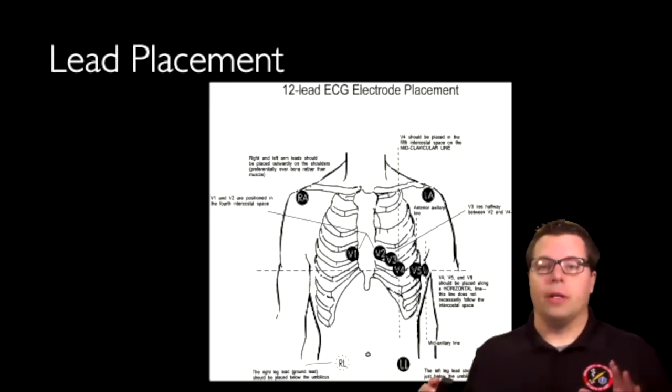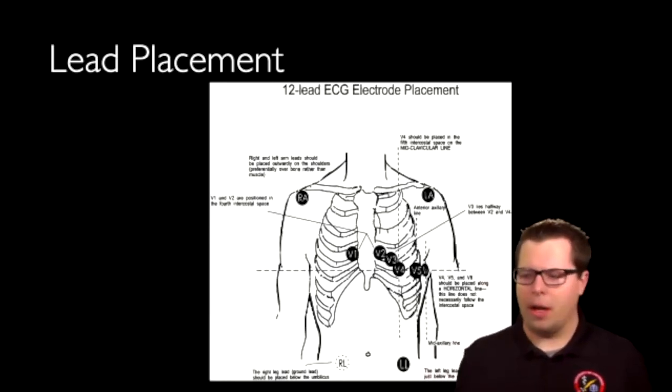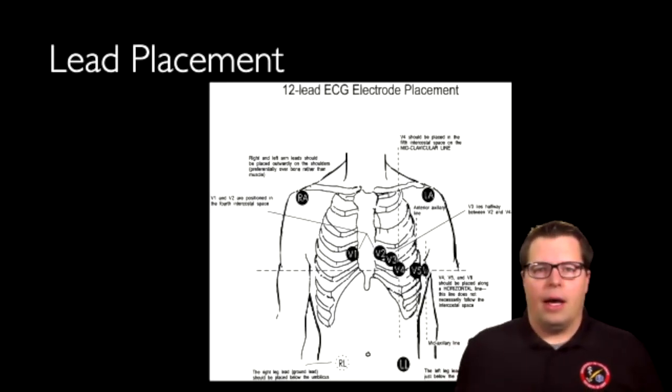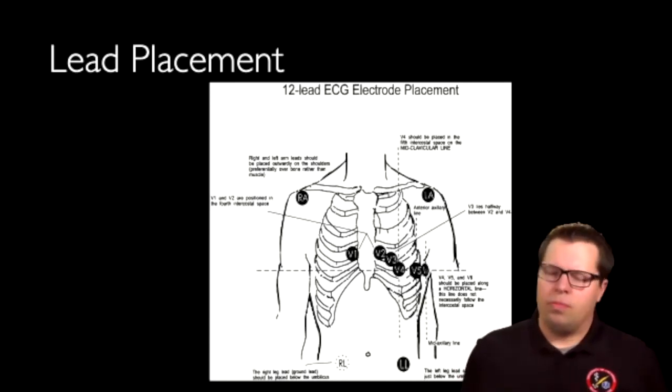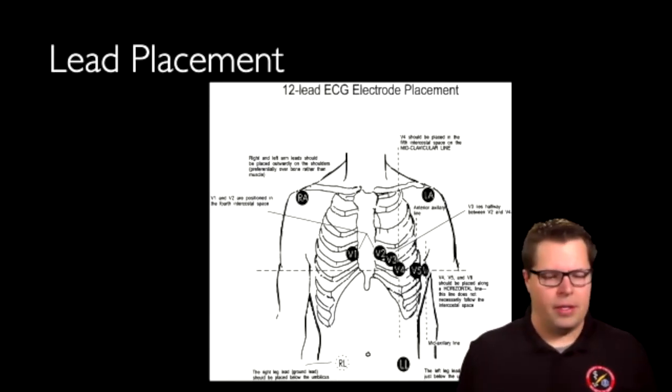So by convention, if we're going to work in the system that we're set up with, which is what we got to do, then you got to put the leads on the right spot. So lead placement is a skill. It's an important thing to do. Everybody thinks they know how to do it, and that's cool. Most people do know how to do it, but you got to actually implement and do it right.